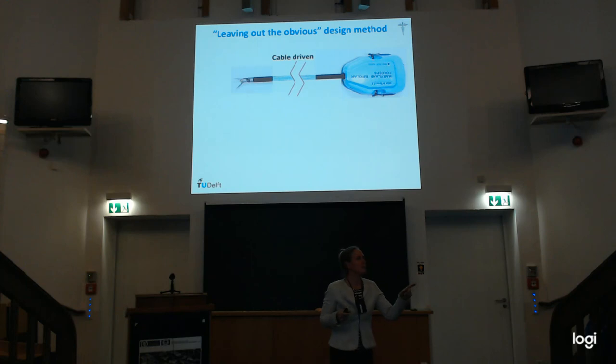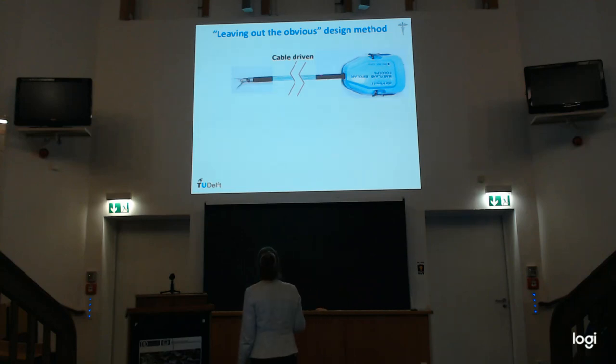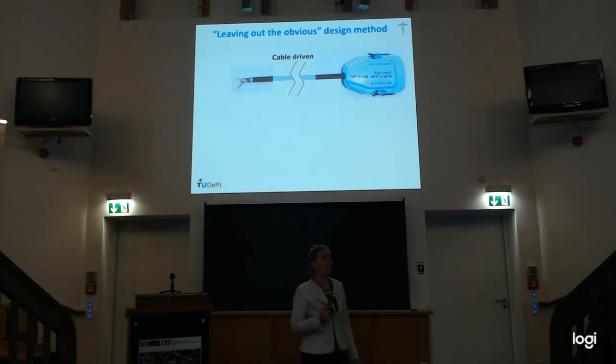During this workshop, I saw the tool. These are cable driven, and it's really problematic. After 10 times using it, it has to go back to the company. A very expensive instrument. They say that you can clean it, but it's not really cleanable because of these cables. And also, if you want to get it, they do not supply it anymore. You're not allowed to have cables anymore in the body.